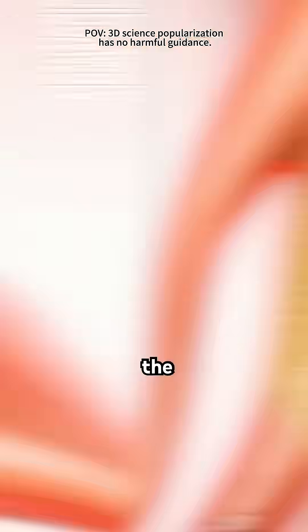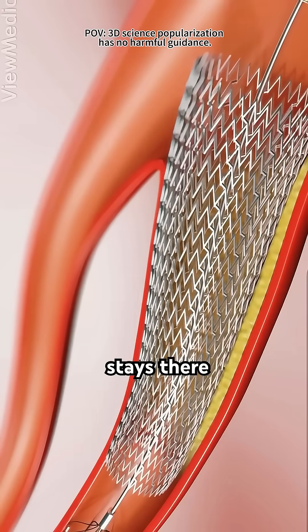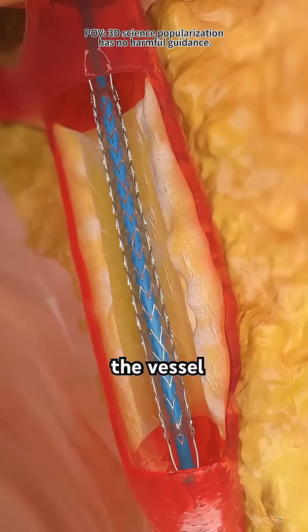To make sure the artery stays open, the doctor places a small metal mesh tube called a stent. It stays there permanently, like a little support beam, keeping the vessel open and stable.